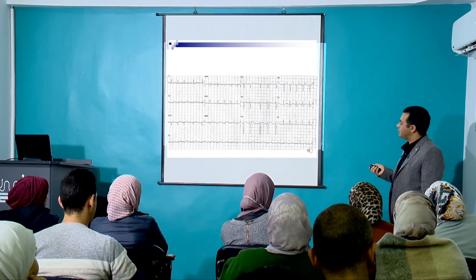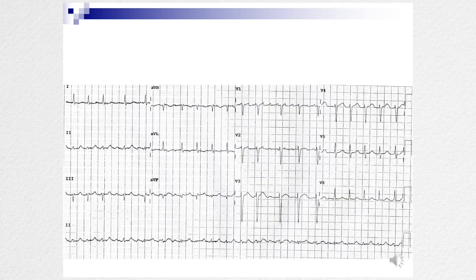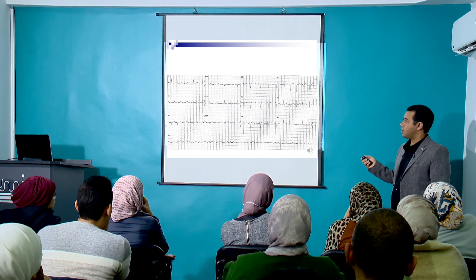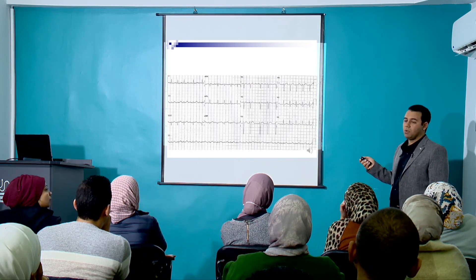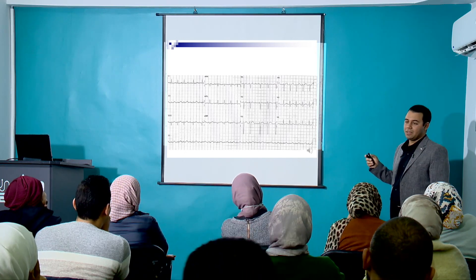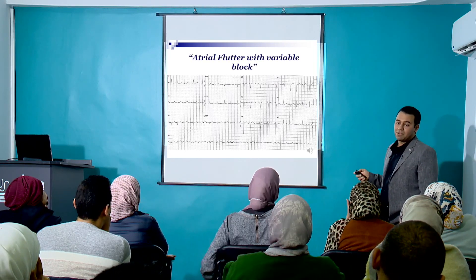Narrow complex, irregular, tachycardia — P waves. What's this? Can you count more than three different shapes? No — they all look the same. So this is not MAT. This is atrial flutter with variable block, i.e., atrial flutter with variable conduction.